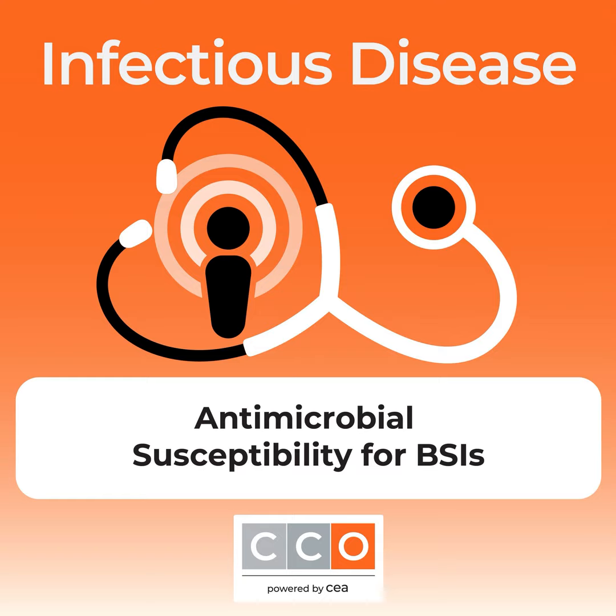Now, do we need data to see how this translates to clinical outcome? Sure, but every facility is different. If you look at a small community hospital without the same resources as a big academic center, you will have a completely different outcome and a different impact. But just by a rational approach, if you, as a pharmacist or an infectious disease physician, are able to get a full AST for your patient with a bloodstream infection 40 hours in advance, don't you think that can make a big change for that patient?